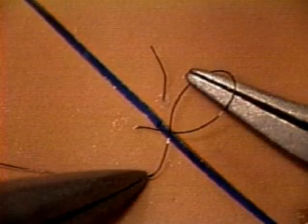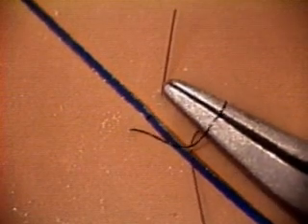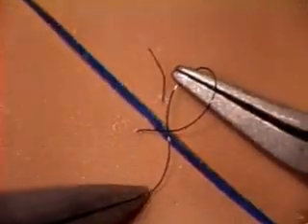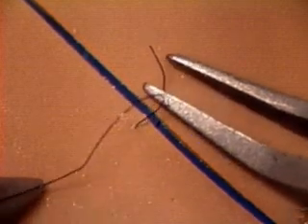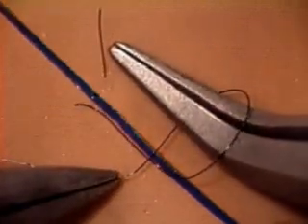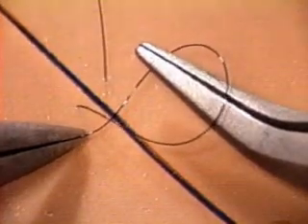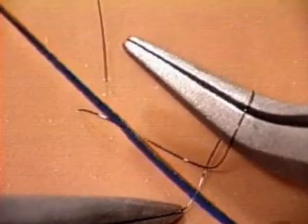There are 3 mistakes in loop making which all result in the loop falling off the forceps. The first is to make the loop too tight. The second is to have it perched too close to the tip of the forceps. Here's what you want, a loose loop back here on the forceps. You can guide it there if you need to by pulling with the left hand forceps, like this.